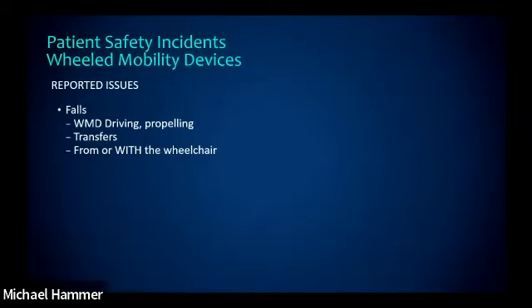Key issues that are adverse events that we experience all of the time is falls. So I'm going to go through some of the key issues where we have incidents reported, and individuals commonly experience falls from wheeled mobility devices, and there's a variety of reasons. We'll go through some of those. You would be surprised at the kinds of falls that occur. It's not just when people are transferring in and out of devices, but while they are propelling a manual wheelchair, while they are driving a power wheelchair with various types of controls, people are falling out of their wheelchair. They're falling with their wheelchair.